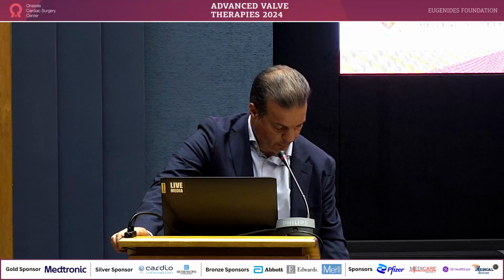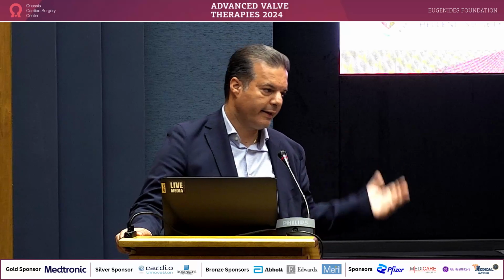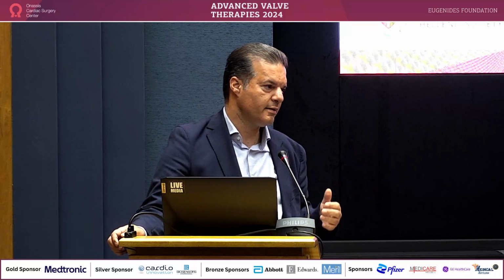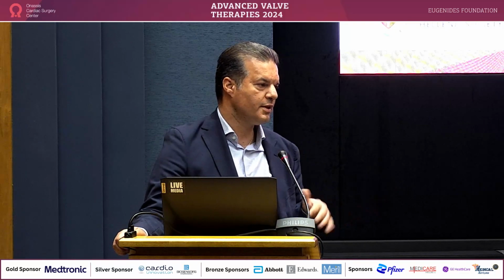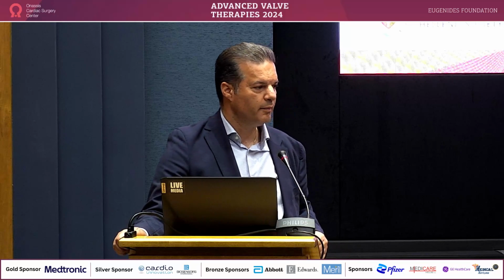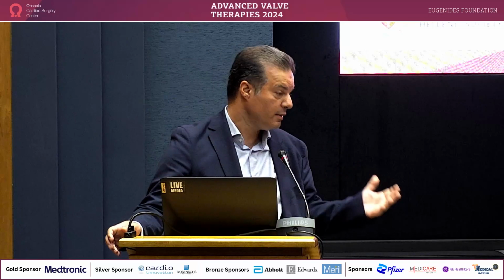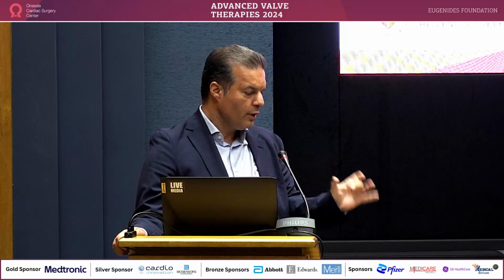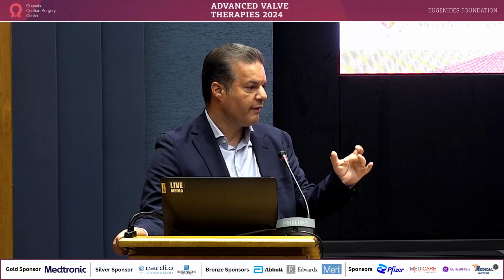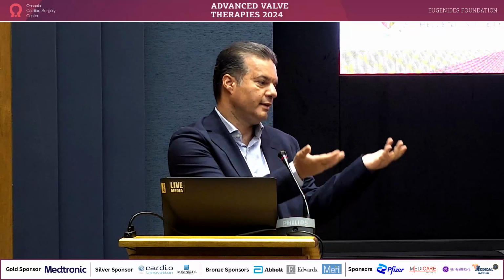Well, as you understand, we went through this case after having lots of email exchanges with Tarek Helmi, Paul Sorajja. Paul Sorajja did a case, and this is why I took the initiative. And he sent me the case, and then I sent this case to him. He said, don't do it, there's not enough calcification. But speak to Tarek Helmi. So I spoke to Tarek Helmi. Tarek Helmi said, do it, I think you can do it. So we discussed with the patient, we agreed to do it. But the problem is, if you don't have enough calcium, you don't have enough anchoring, your valve can embolize because the closing forces on the mitral are higher than the diastolic forces on the aortic. So you really have to have good anchoring.